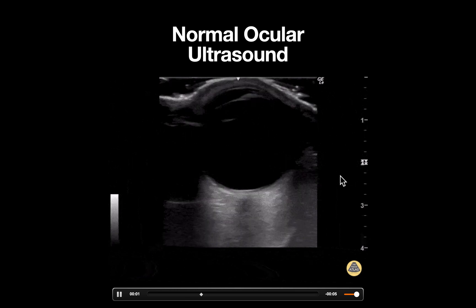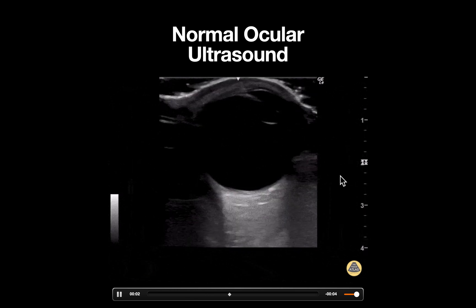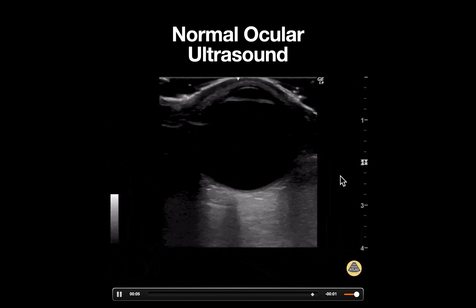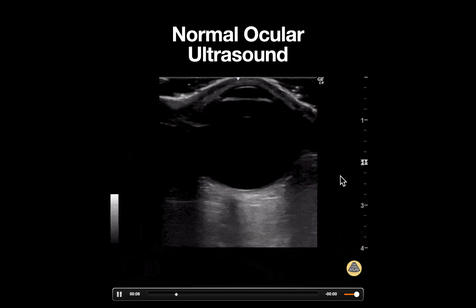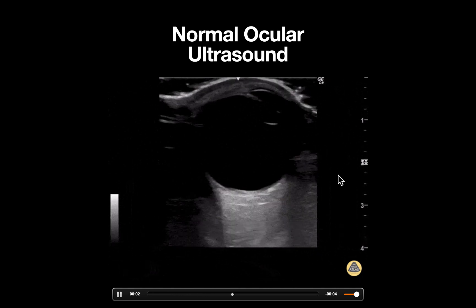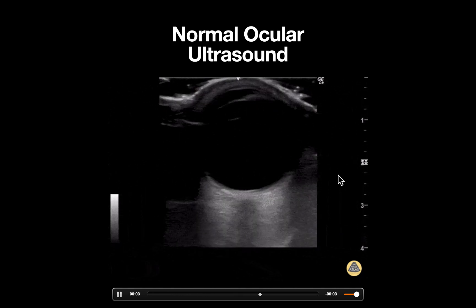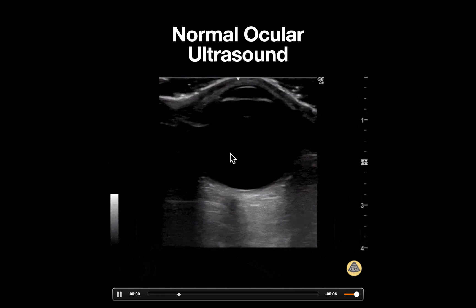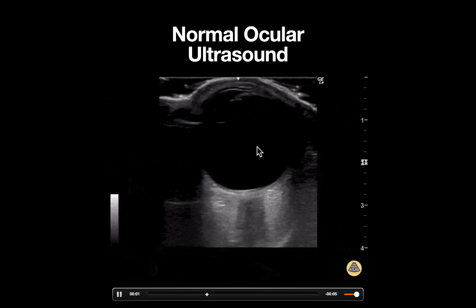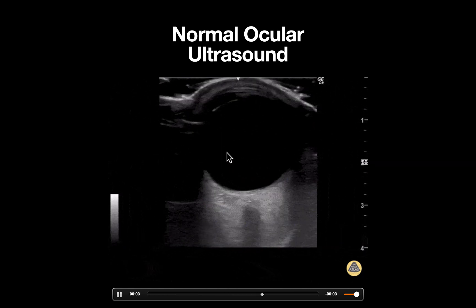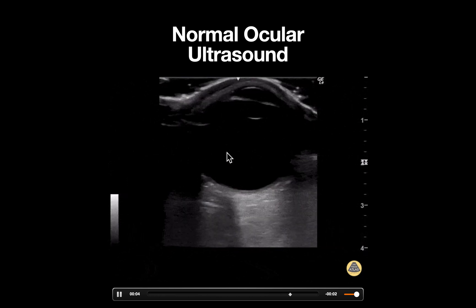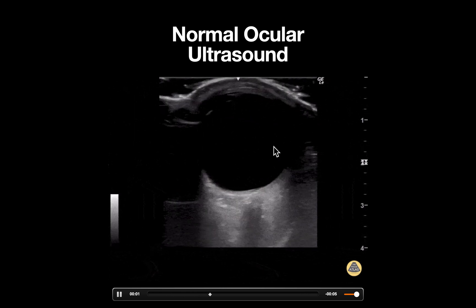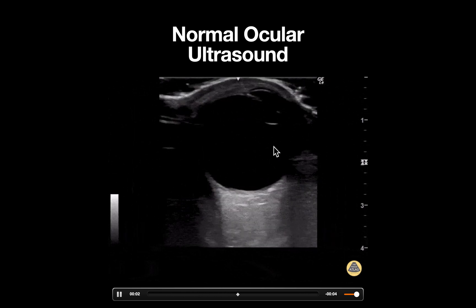When performing ocular ultrasound, it's important to remember that this is a dynamic examination. After placing the transducer in a transverse orientation, the patient should be asked to look up, down, left, and right to evaluate the entire globe, looking for any signs of echogenic debris or membranes within the vitreous that would be indicative of pathology.